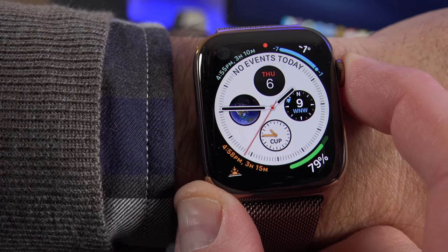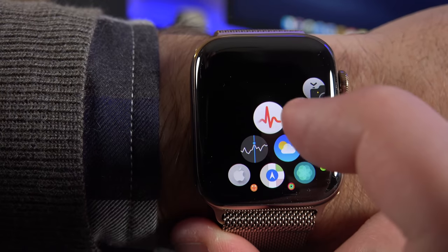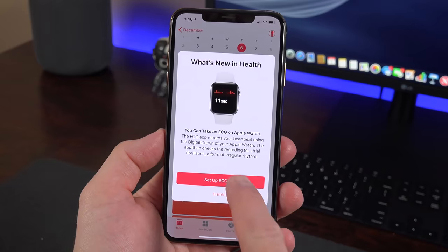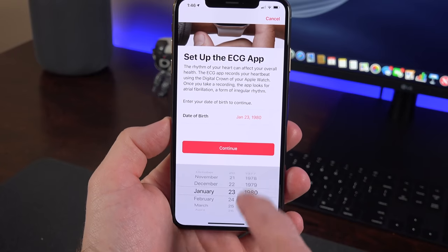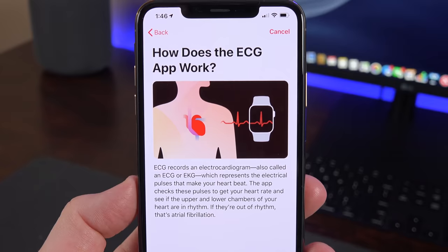Once you're updated, you'll see a new app appear on the Apple Watch. This is the EKG app, and when you first launch it, you're prompted to go back to the Health app on your iPhone to set it up for the first time. The setup process really just involves establishing your date of birth so it knows how old you are, and then it explains exactly how this works, how to use it, and what the results mean.